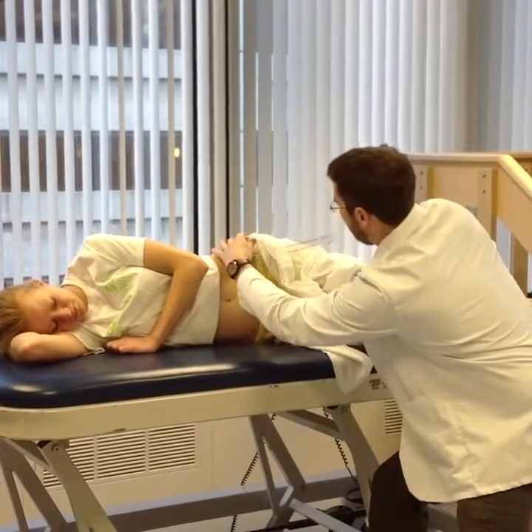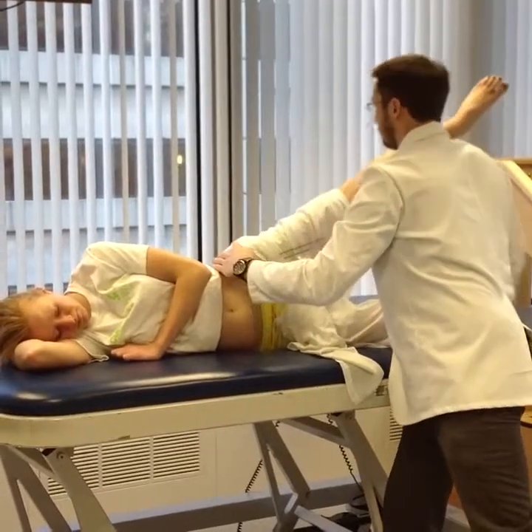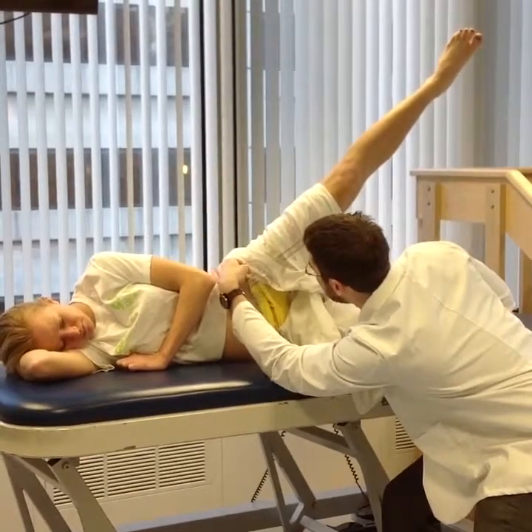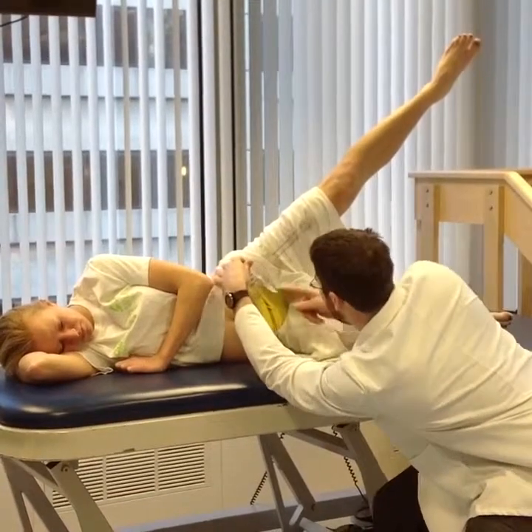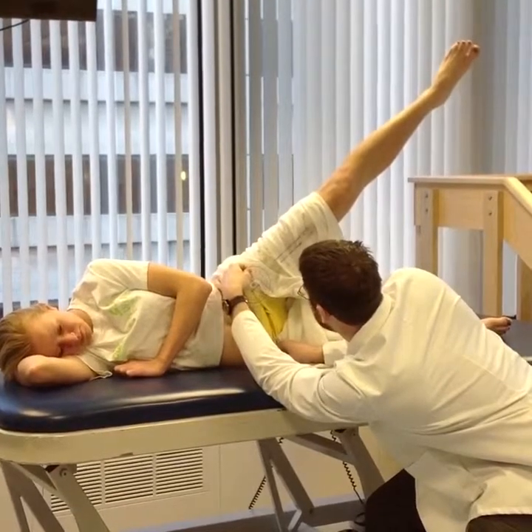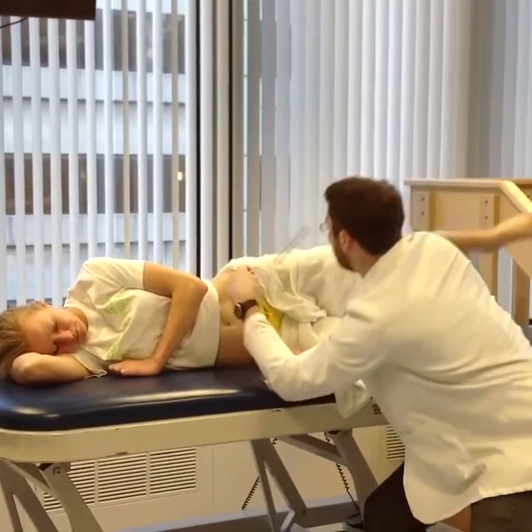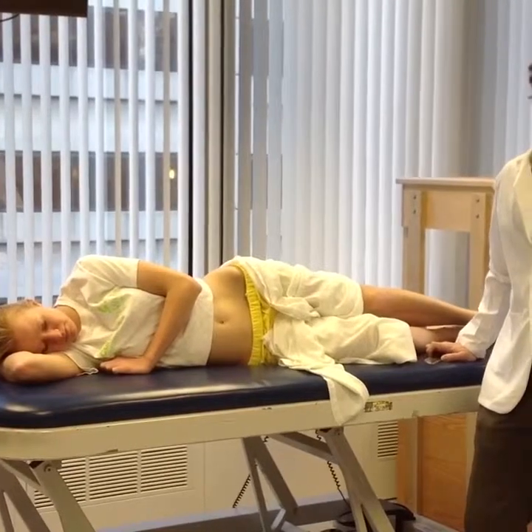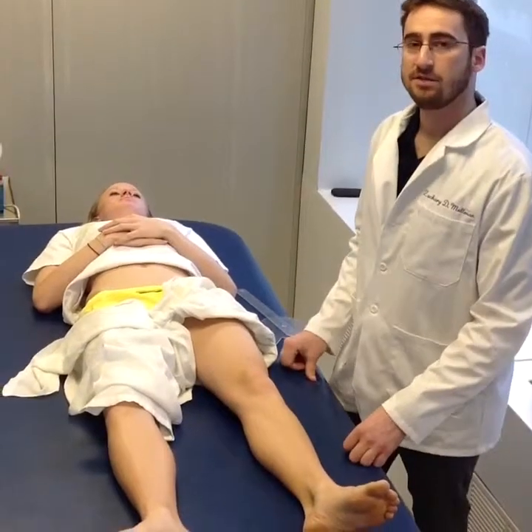Alyssa, whenever you're ready, you can go and move this leg towards the sky. Good — you stayed in great alignment. I'm still feeling for compensation; your trunk stayed very neutral. I have my goniometer at 90 degrees from ASIS to ASIS. She had great hip abduction — even greater than 45 degrees, which is perfect. We're looking for about 40 to 45 degrees.